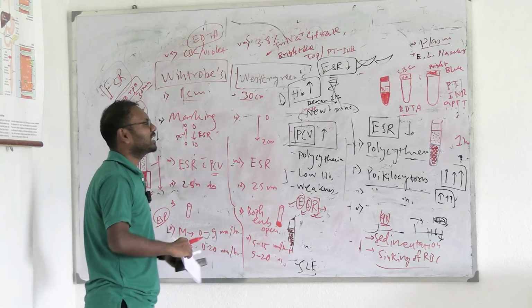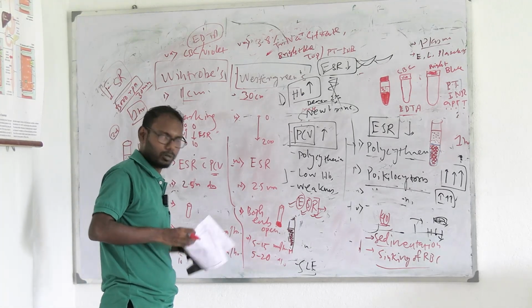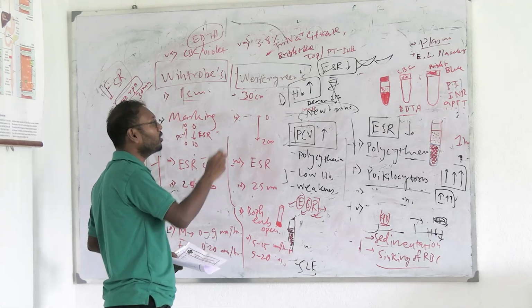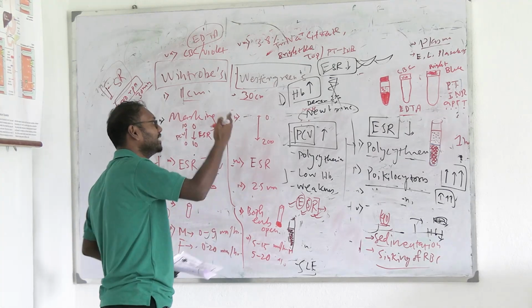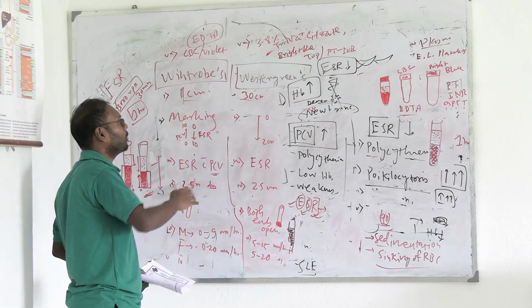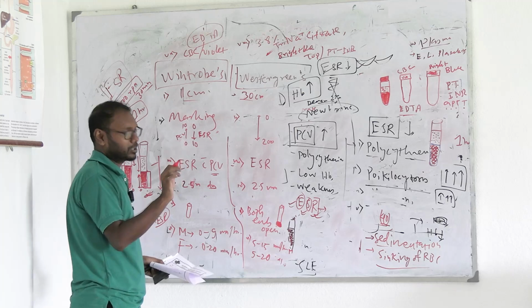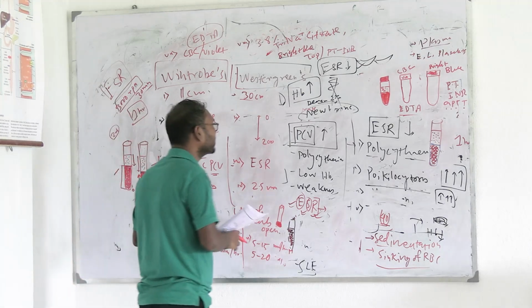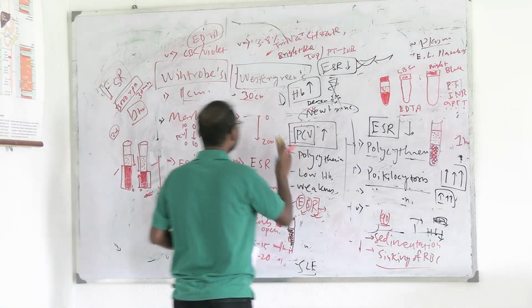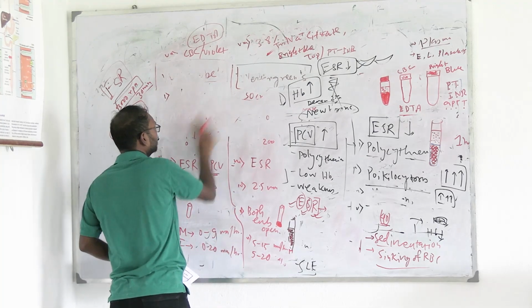Now since we have discussed all these things, now we will be discussing the clinical factors. এবার আমরা যেমন থিওরি ক্লাসে পরপর পড়তে আসি, প্র্যাকটিক্যালে আমরা সেইভাবেই পরপর পড়বো. এরপর আমরা কি পড়বো, the factors affecting ESR. Okay, so now we know about the normal results, now we know about what is ESR, now we will know about the clinical aspects. First clinical aspect is the factors affecting ESR. So what are the factors that affect ESR?